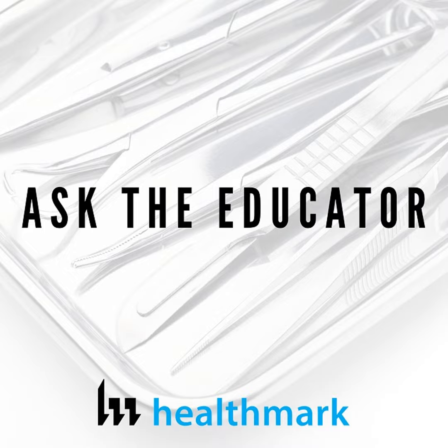It's a totally different story, as you probably are well aware as a former educator in a department. It can be very difficult at times to get everybody on the same page and to get them doing the right thing every single time, especially with shavers. I mean, we're talking external brushes. We're talking probably 2 or 3 internal brushes just for one device, right? Yeah, so it's a lot more complicated than people realize, I think.